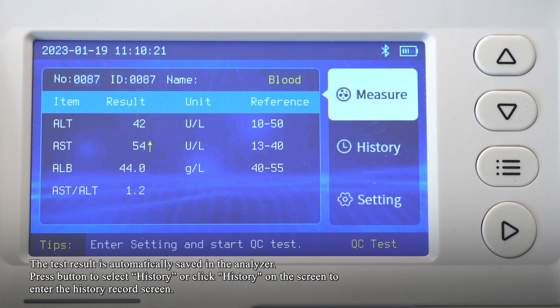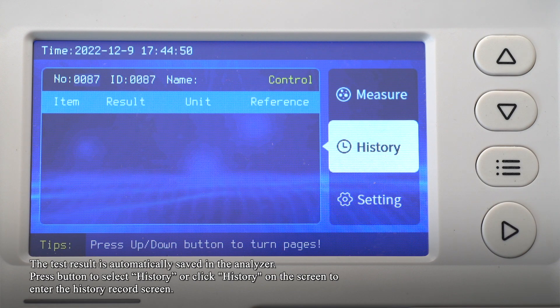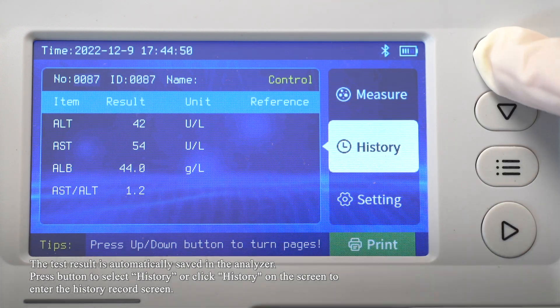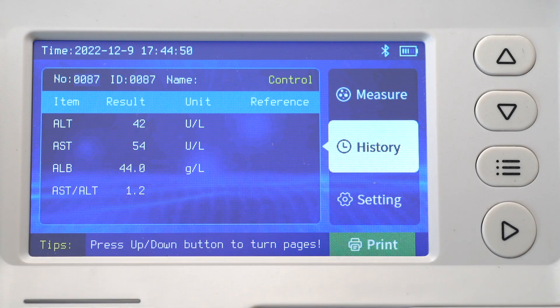The test result is automatically saved in the analyzer. Press the button or click History on the screen to enter the history record screen. Press the Up or Down button to turn pages and view history records stored in the analyzer.